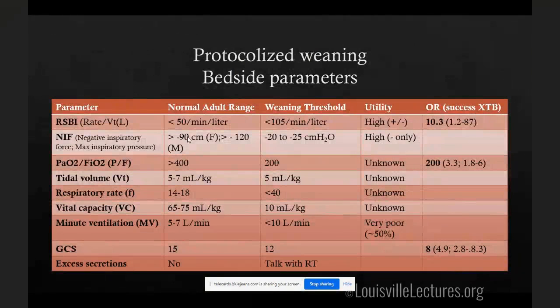Just think about that intuitively, because the goal of a vent, if we simplify it, is to give the patient oxygen to get into their blood to participate in metabolic processes. So if you can internalize that, and this is as simple as looking at what they're getting on the vent and looking at what the blue number on the monitor looks like, that's the first couple weeks of NICU right there.